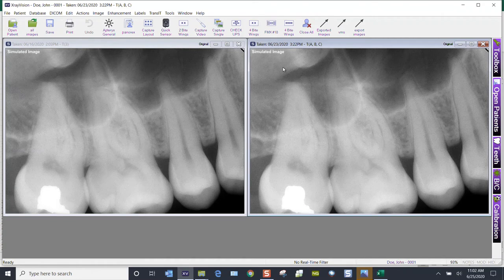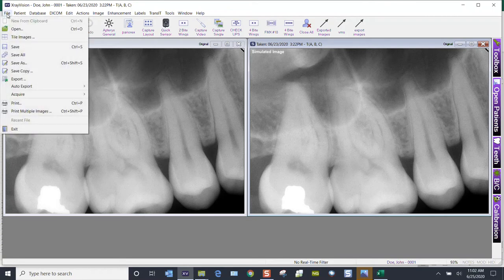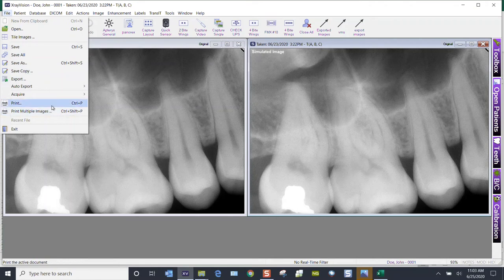If you needed to print multiple images, come to File and Print Multiple Images. You have the keyboard shortcut Control+Shift+P for that.